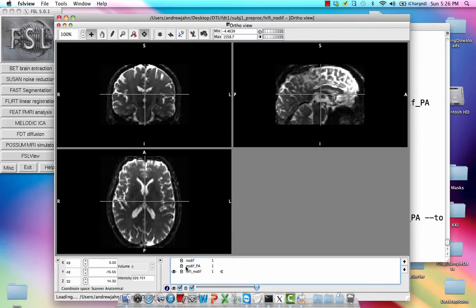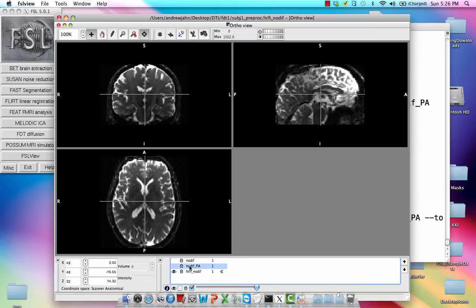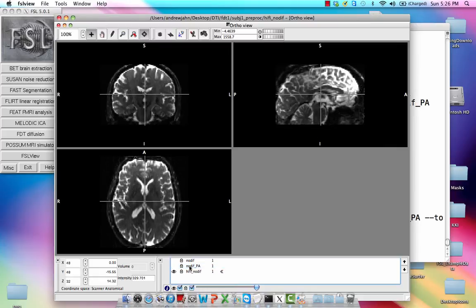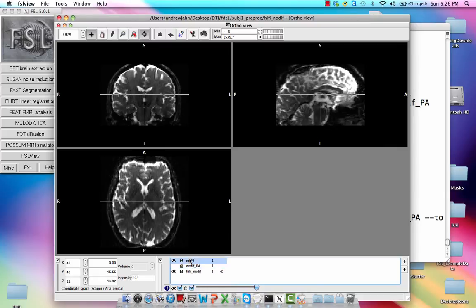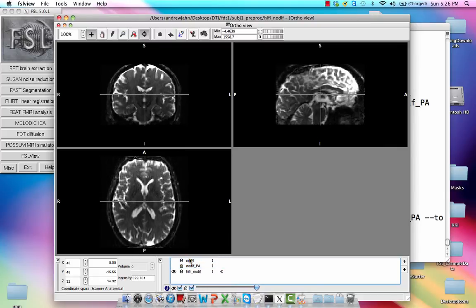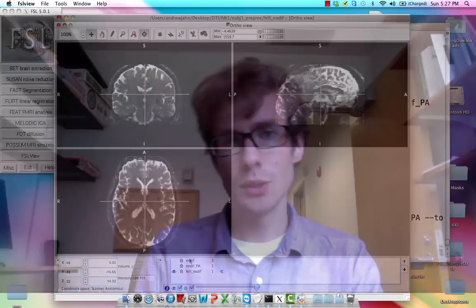So if we look at that, this hi-fi no-diff, this is the corrected image after top-up has been applied. Notice if I look at one of them, it appears a little bit elongated in certain parts of the brain. And the other one looks a little bit squashed. This has basically taken both of those into consideration and it's looked at this estimation of discrepancies file or this estimation of distortions file and used it to correct these images.